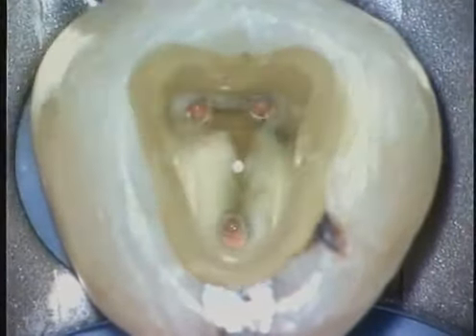Because the C-shaped molar has a deep pulp chamber, which is usually subcrestal, it's a long distance from the occlusal table to the pulpal floor. In the instance of a vital case, blood may be emanating from the midst of the pulpal floor, giving the clinician insecurity as they may think they've inadvertently perforated the floor of the tooth.